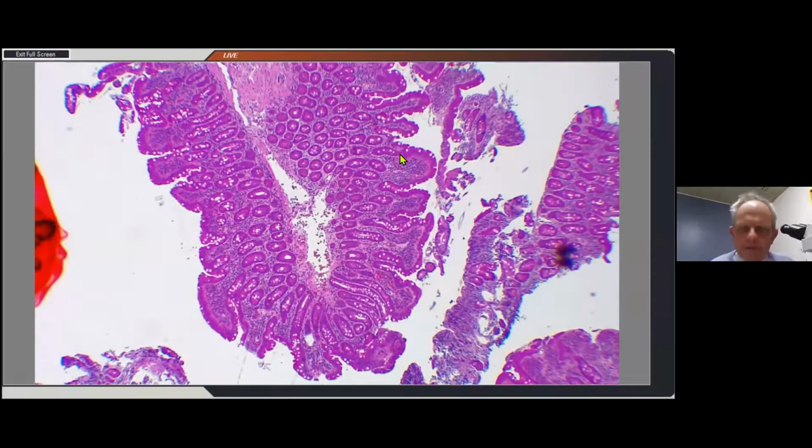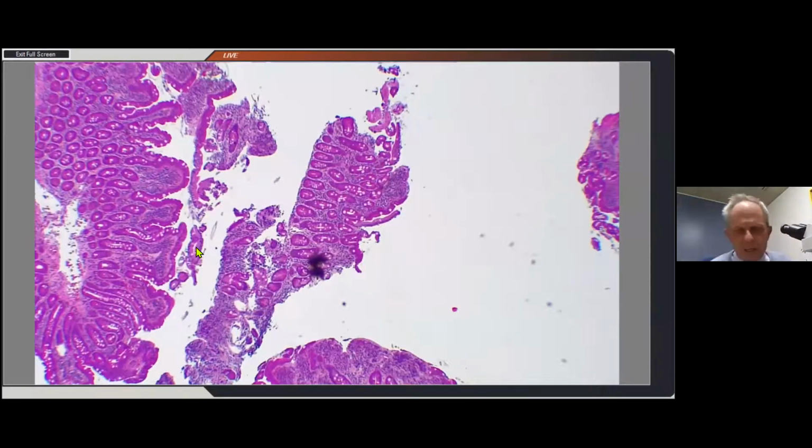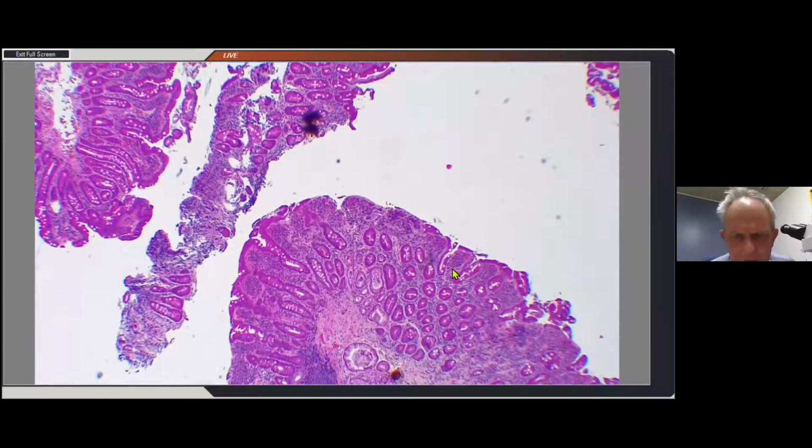we remember our photograph that we took of the normal duodenum, and you can see that there is a flattening of the villi. And you can see there's probably a 1-to-1 ratio. That's the crypt base there. That is the top of the crypt. There's the base there. So between there and there, and there and there is about 1-to-1. So you've definitely got atrophic changes. It is variable. For example, here it looks as though, in fact, it's far less than 1-to-1. And then as we move over here, there is a suggestion that there is complete atrophy. So we know then that there is duodenal atrophy.